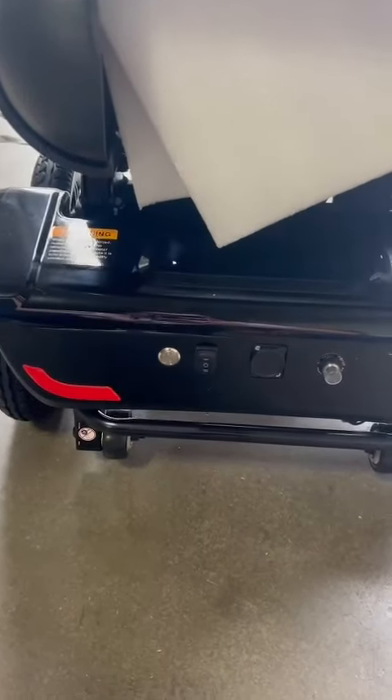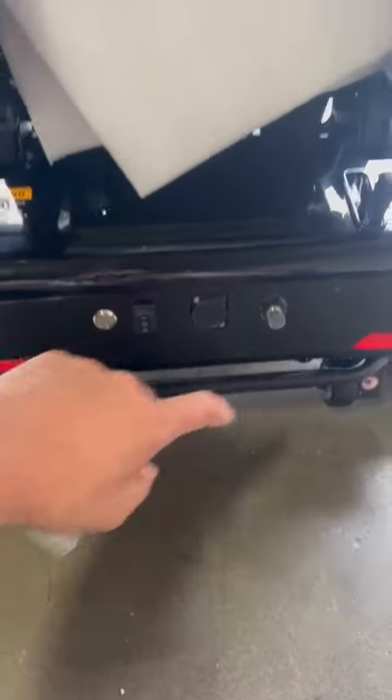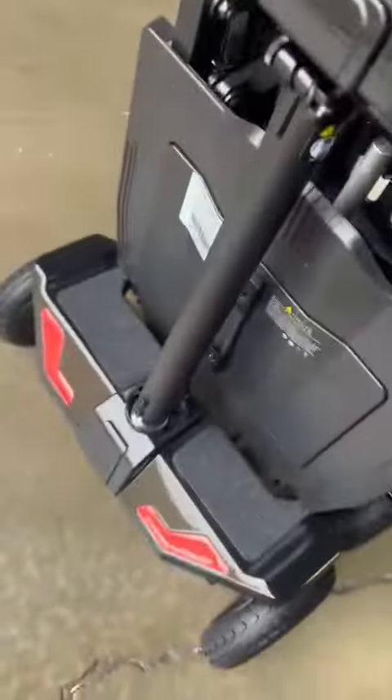Okay, this is the auto-fold scooter. Let's see how it works. First, you install the battery.